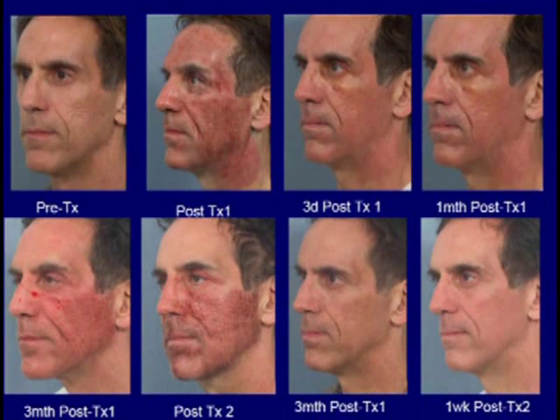The other area we're looking at is acne scarring. And this has worked out quite well also. You can see the response here. We're a bit more aggressive as we're treating these patients. Again, we began to increase the energy and the number of microthermal zones per patient. But here, even at 3 days, the healing is very quick.